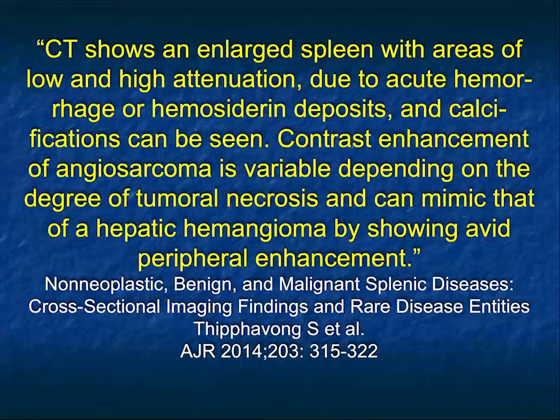So what should we start with? Well, when you think about malignancies in the spleen, metastases are common, but patients with Mets often will have metastases to the liver and adrenal glands. Things like melanoma, renal cell are distinct possibilities. Primary tumors, again, are unusual: lymphoma, angiosarcoma, which is very rare.